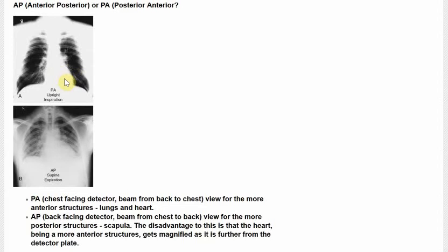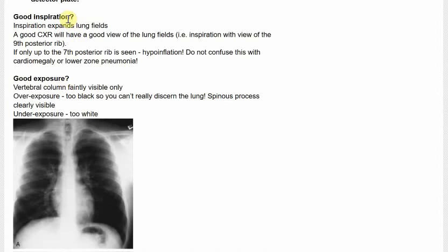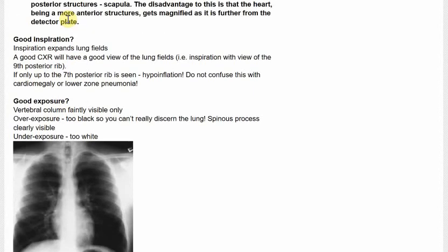In AP, however, which commonly happens when people are more unwell, the back is facing the detector. So the beam goes from the chest to the back, and the heart structures get enlarged because the heart is mainly sitting anteriorly. So as you can see there, the heart does look bigger compared to the PA film. The other technicality to appreciate is inspiration — is it good or poor inspiration?